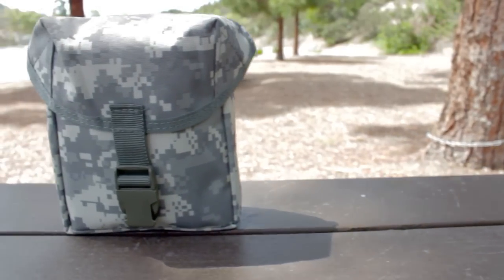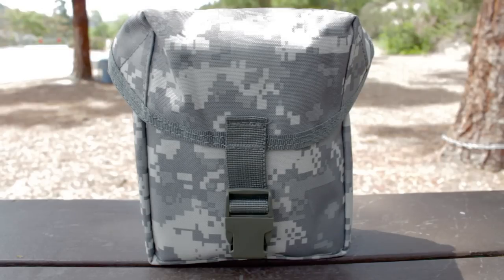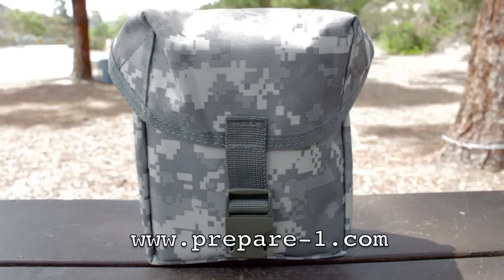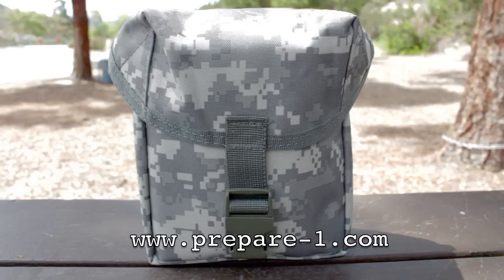This is a great base kit to get you started. All kits need to be personalized based on skill level, location, and the type of activities you mostly do. You can find this kit by going to www.prepareone.com.